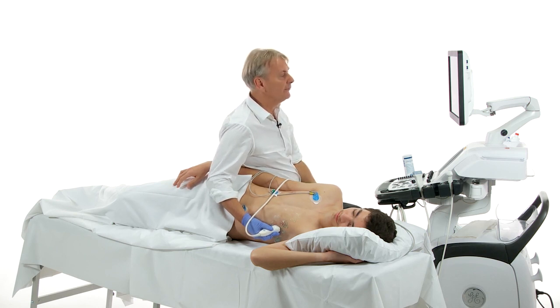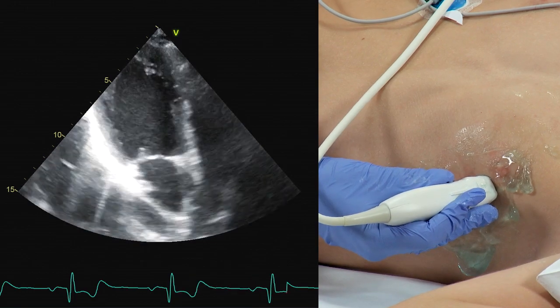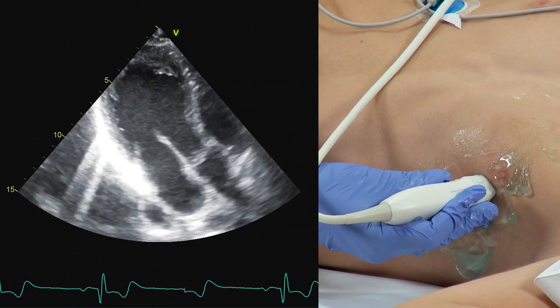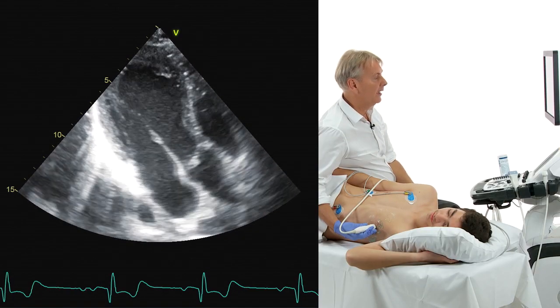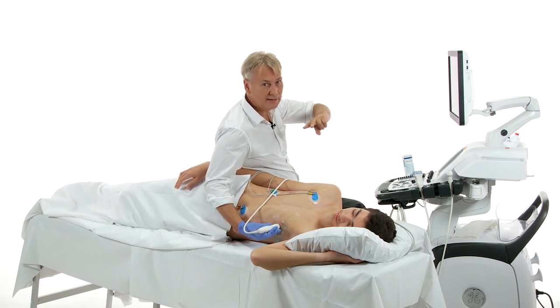This is now the two-chamber view, and now I'm rotating counterclockwise even further without losing contact with the body and without tilting until I get the aorta, the LVOT, and the papillary muscles into my field of view. So in this case, I get a very nice three-chamber view. However, very frequently it will be difficult to stay in the axis, especially if the intercostal spaces are not oriented perfectly to the orientation of the three-chamber view.